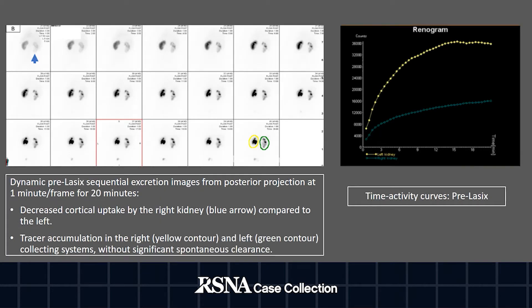Dynamic excretion images at 1 minute per frame for 20 minutes show decreased cortical uptake in the right kidney and normal cortical uptake in the left kidney. By the end of the 20 minutes, there is radiotracer accumulation in both collecting systems with no significant spontaneous washout, as we can see as well on the time activity curves.